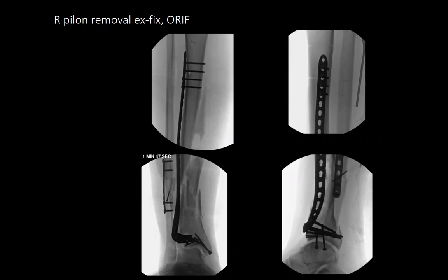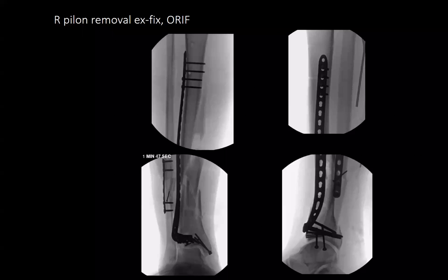Well, if you slide it up, you're not dissecting it out, you're just adding. So what's the concern? What's the deformity that may develop? You could go into varus. Yeah, because all your fixation is laterally giving you kind of a valgus buttress, and you have all your comminution in the shaft and medially. So you have to keep a close eye on it, because depending on how quickly it heals, it'll slowly start falling into that.